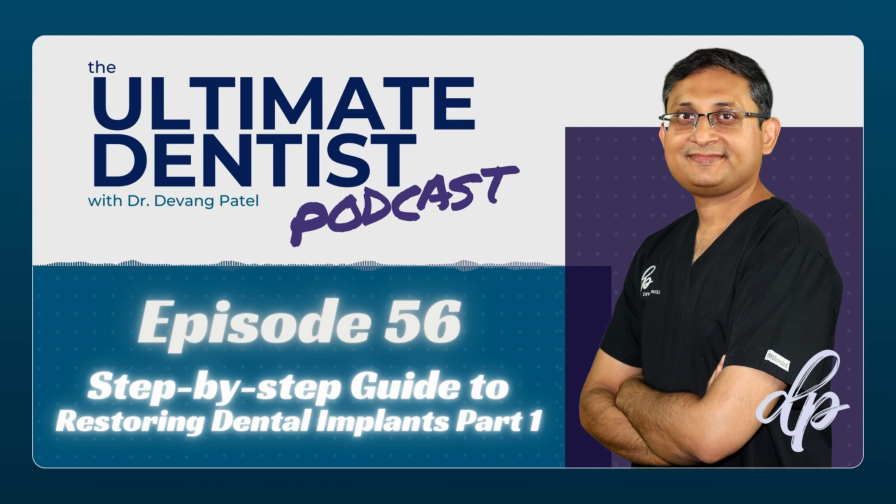So these are the 12 factors: patient expectation, treatment alternatives you need to discuss, denture, bridge, or no treatment, smile line, oral hygiene, adjacent teeth if there is anything you need to do, complementary treatment, whitening, cosmetic treatment, ortho, full mouth reconstruction. You need to assess restorative space. You need to assess hard and soft tissue. You need to assess how many implants patient will need. You need to assess how to provisionalize, or whether to provisionalize the edentulous space at all. And you need to assess occlusion and do diagnostic wax up.